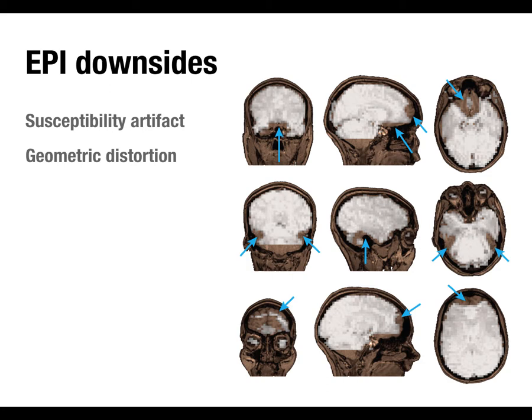Usually, if that's the case, it's more because they have metal pins or something. Like they'll use metal screws to attach the skull back after they've put it back in. So there are other issues there.